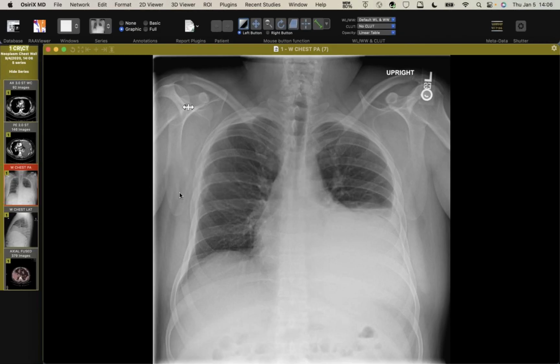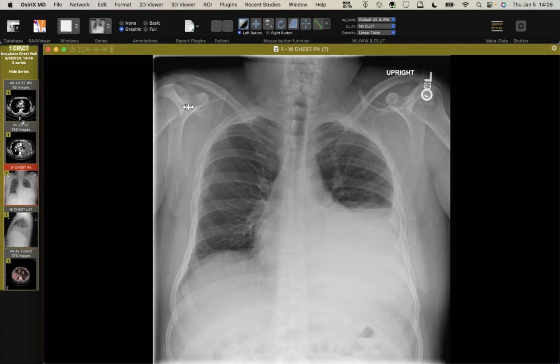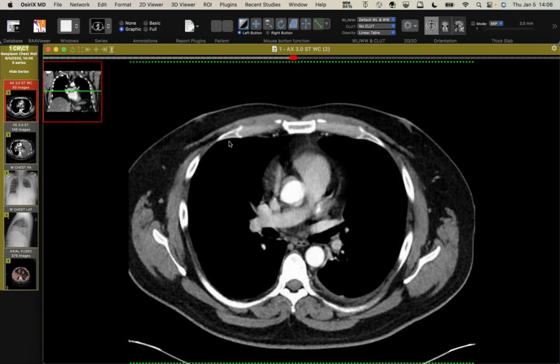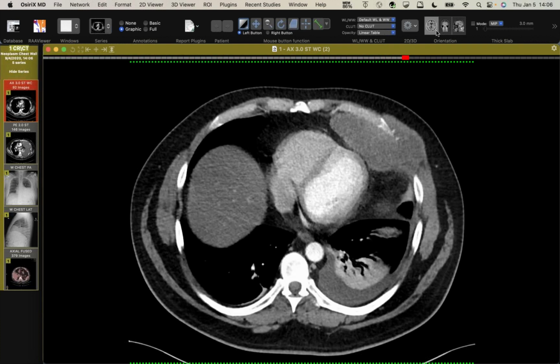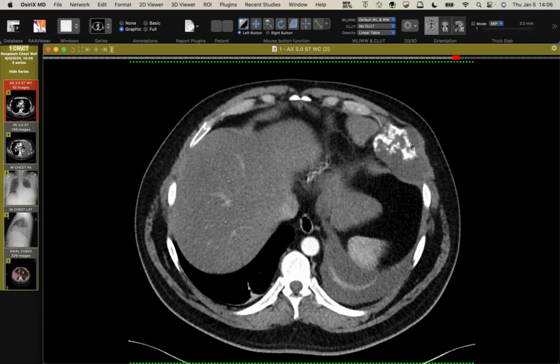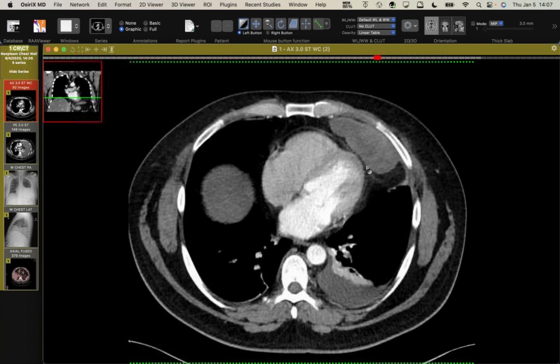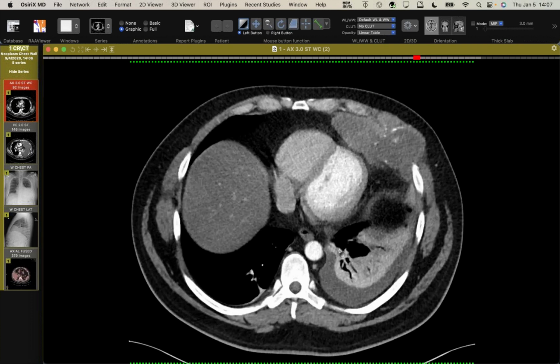So this guy is in his 40s and presented with a chest wall mass. And you can see this abnormal density here. And if I show the lateral view, you can't see it quite so well, but it also looks like there's an intrathoracic component in there, maybe an effusion or something. So he underwent a CT scan at the outside, and you can see there's this large mass here in the chest wall. Now this part here is centered on the rib, and you can see it's destroying the rib, but it also has a lot of matrix in it, whereas this component here doesn't seem to have any matrix in it. It's sitting in the prevascular mediastinal fat. There's a little bit of effusion.